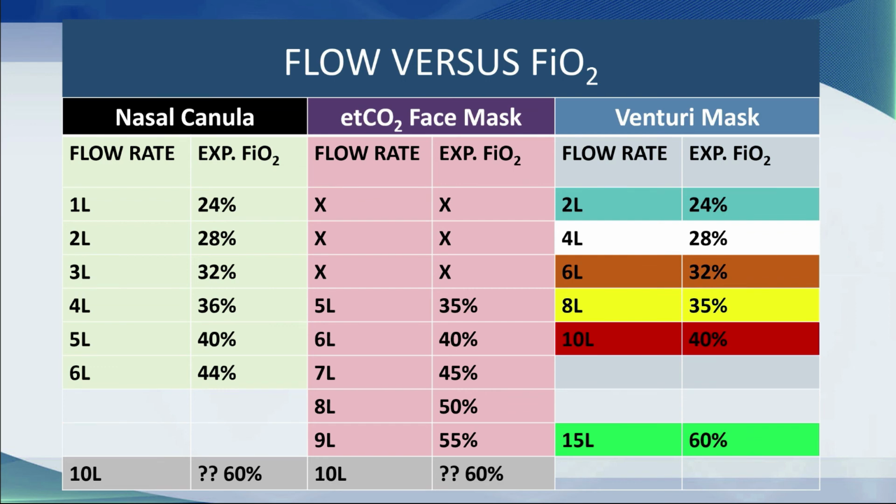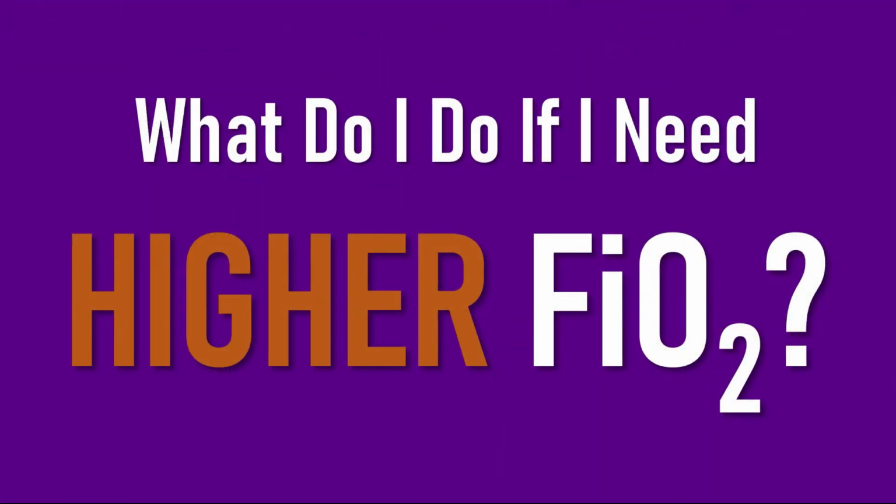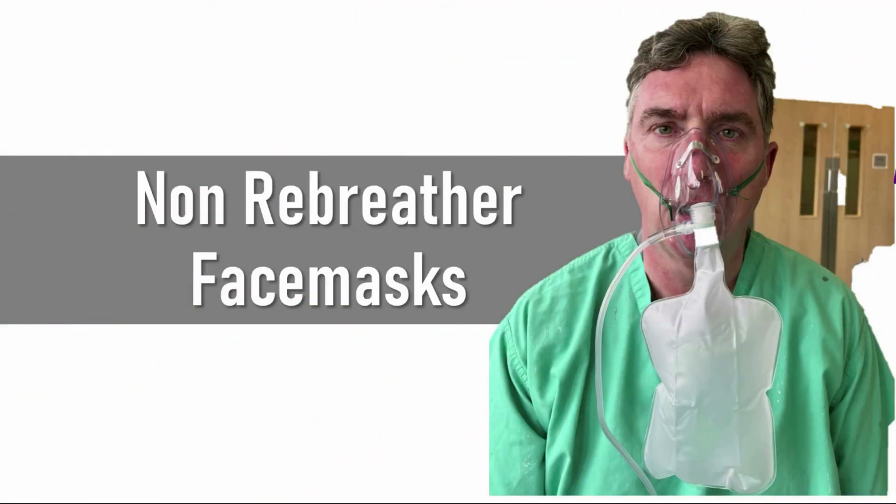But it is quite astonishing how the standard devices that we have are not that precise. There isn't an easy way of giving either 30 or 50% oxygen to a patient. If you need a higher FiO2, you should consider in the short term a non-rebreather face mask, here modeled by me.